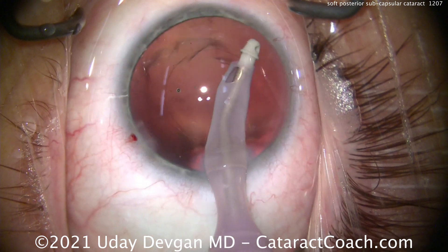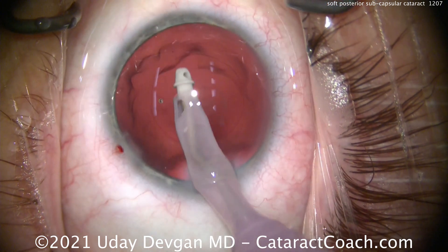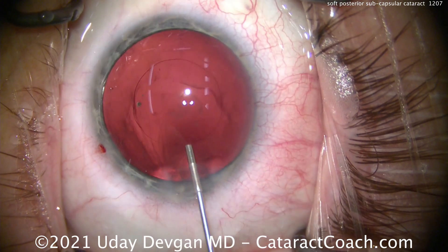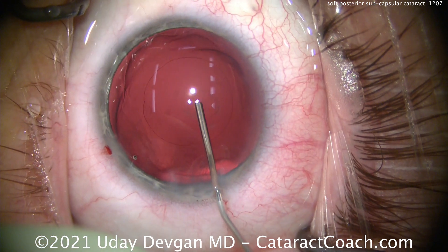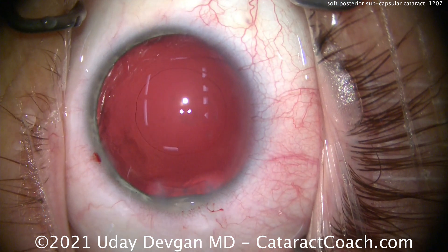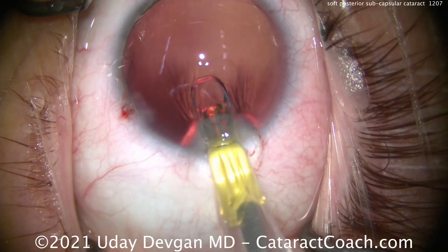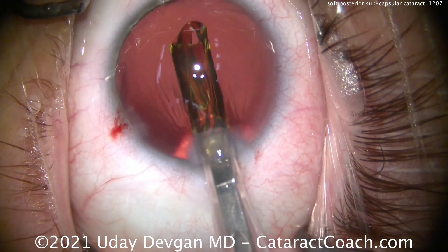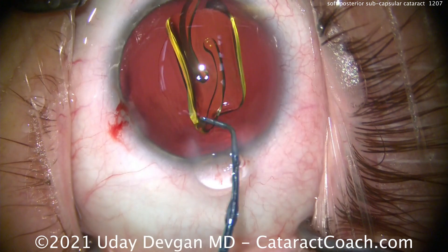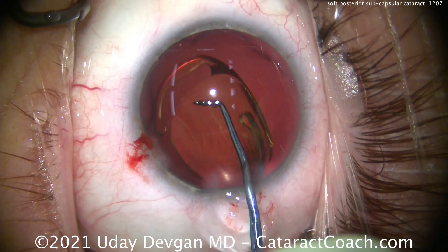The anesthesia for this patient was systemic midazolam (brand name Versed) plus topical tetracaine, and intracameral preservative-free lidocaine diluted 50-50 with balanced salt solution to one percent. Filling the capsular bag — look at that beautiful rhexis, a perfect circle. The lens is a single-piece monofocal acrylic IOL, and we are targeting a post-op residual myopia so the patient can have good near vision — computer, cell phone, and reading — without glasses, accepting distance correction for driving and TV.